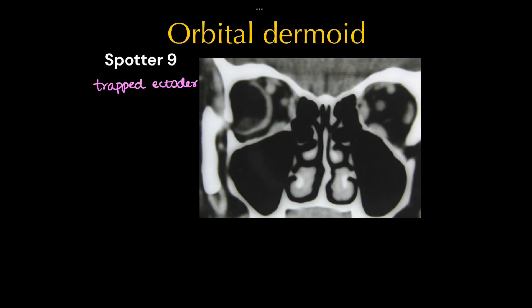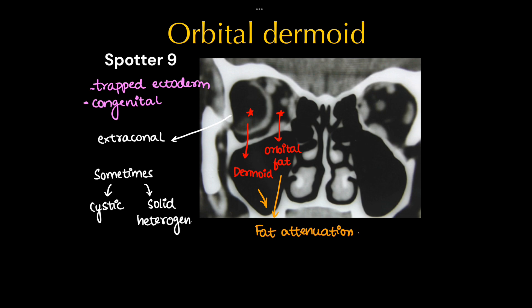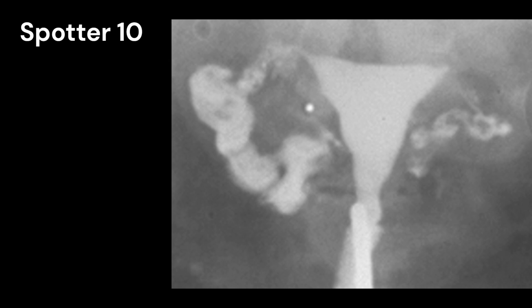This is a case of orbital dermoid. This can show cystic or solid changes with heterogeneous attenuation.